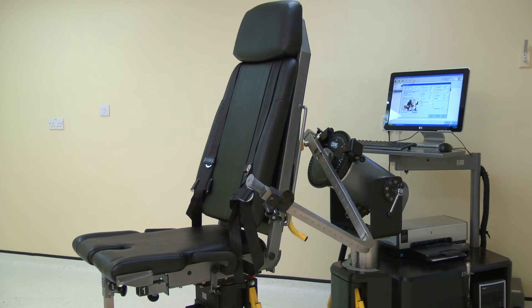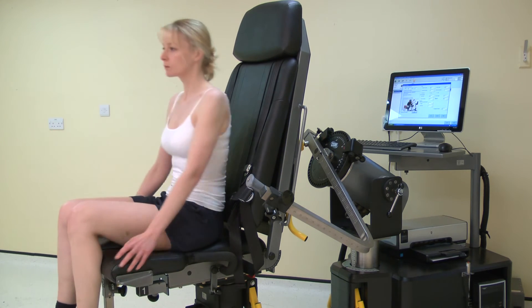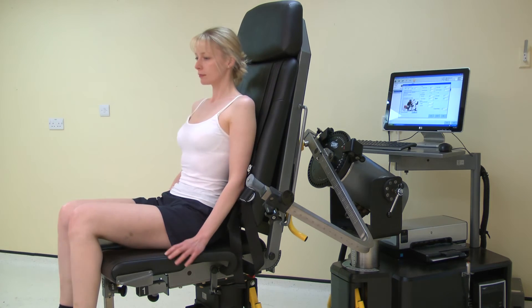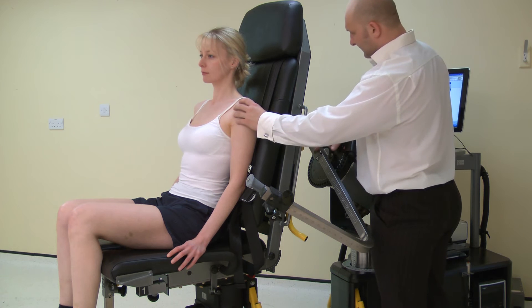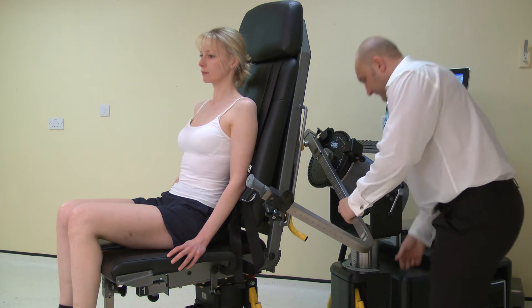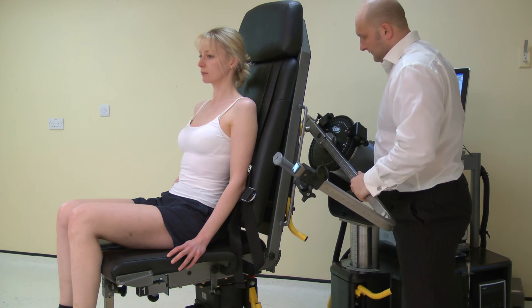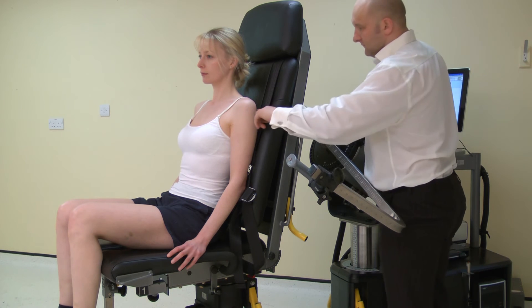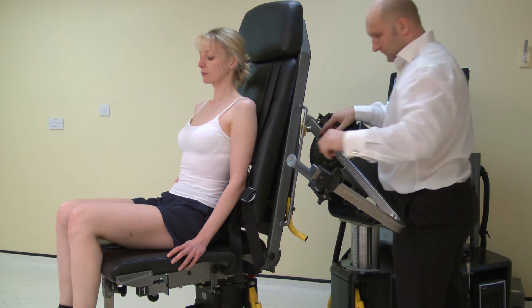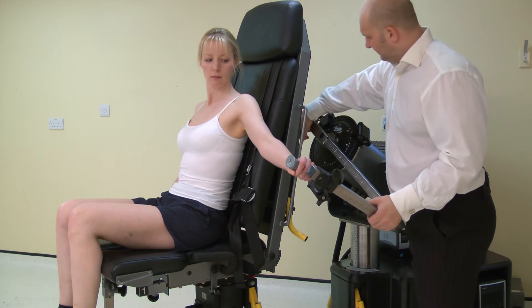Once the norm is positioned, ask the subject to be seated on the chair. The axis of rotation needs to be set — the axis for the joint needs to be directly opposite the black dot on the input arm. The axis of rotation for the shoulder is medial to the acromial process. The chair fore-aft and the dynamometer height may need adjustment to achieve the alignment. Once alignment is achieved, ask the subject to hold the handle. The length of the elbow-shoulder adapter may need adjustment.